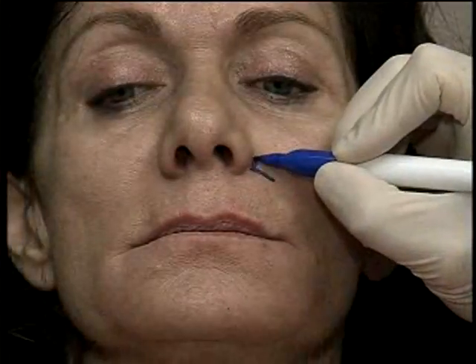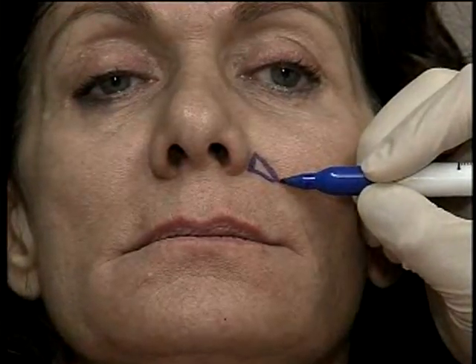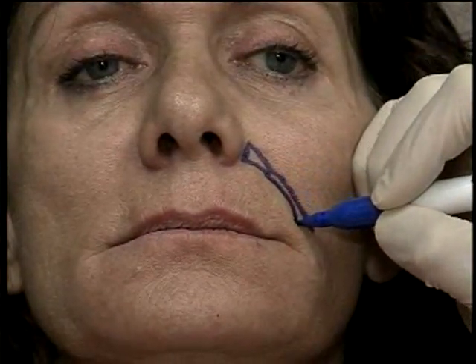So I'm going to go ahead and start the treatment. Now when you're doing this, it's very important that you fill in this crease, this triangle right here. That's really important. So that triangle you want to fill in. And then I'm going to take the product a little bit lateral to the fold, a little bit medial to the fold.